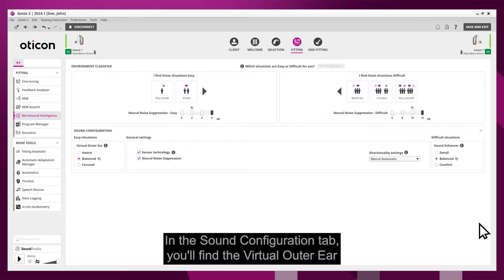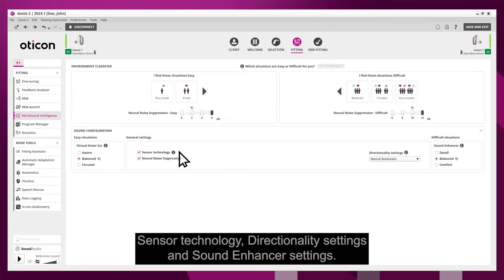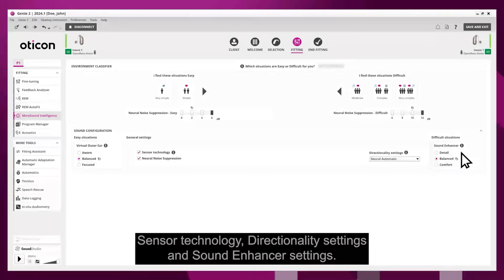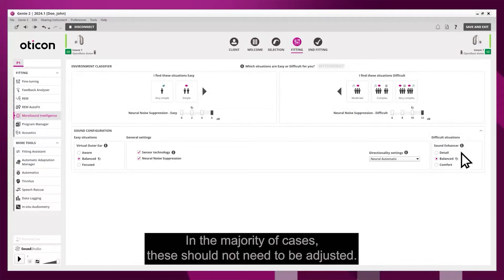In the sound configuration tab you'll find the virtual outer ear, sensor technology, directionality settings, and sound enhancer settings. In the majority of cases these should not need to be adjusted.